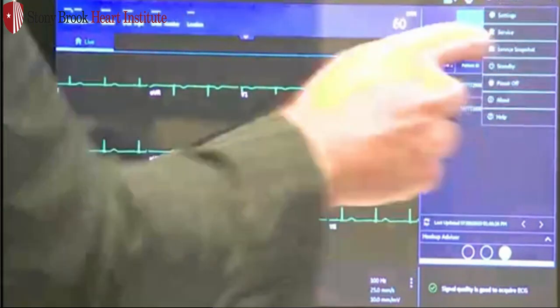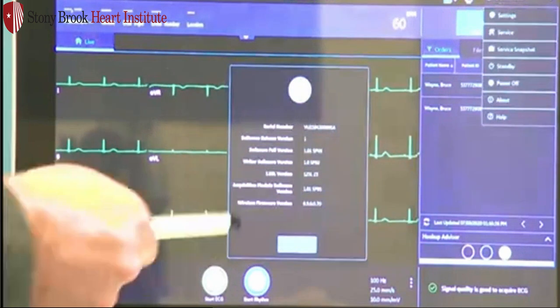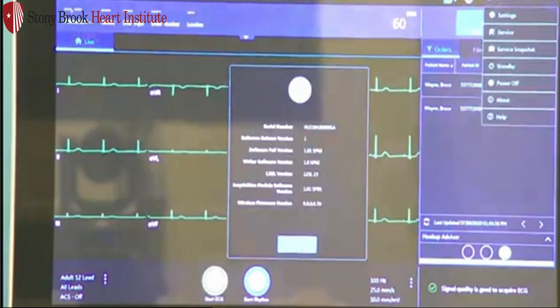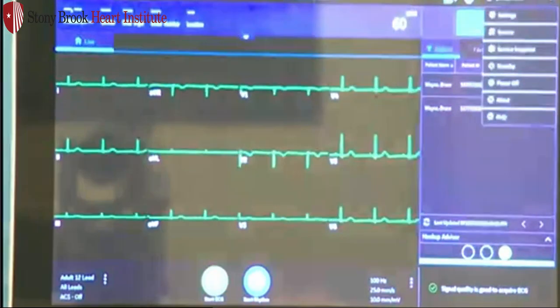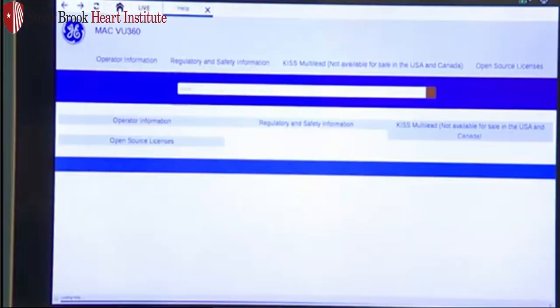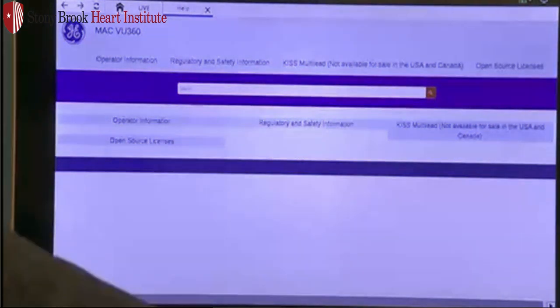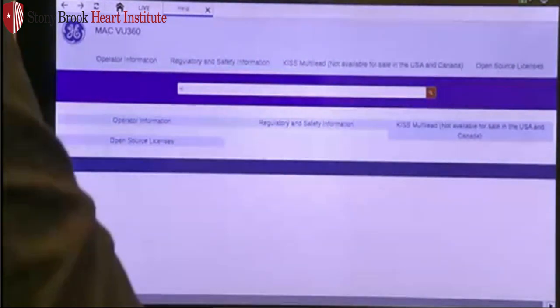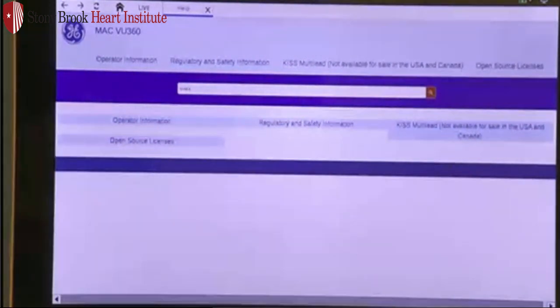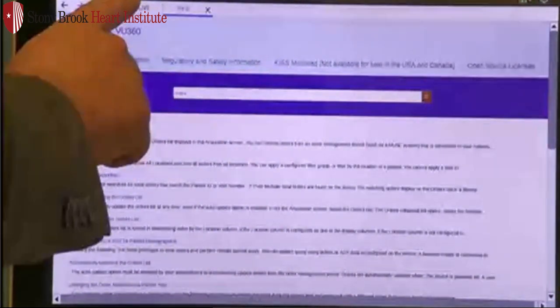There's an about feature. If you need technical assistance, simply press about — it will give you all the information including cellular number and product information. There's also a help button. We no longer provide the large 300-page manuals; the full manual is built into the cart and is very user-friendly. You can search under keywords — for example, if I type in 'orders,' it'll take you directly to that keyword and the relevant chapters within the manual. To return, just hit live.